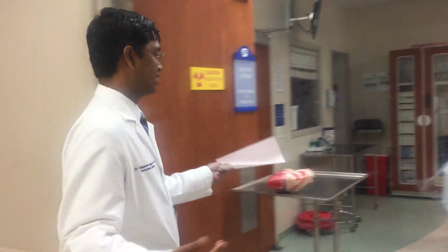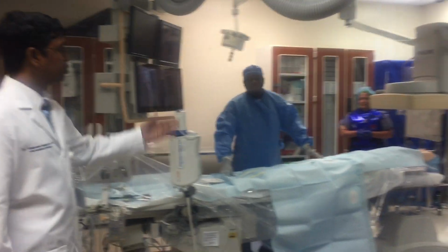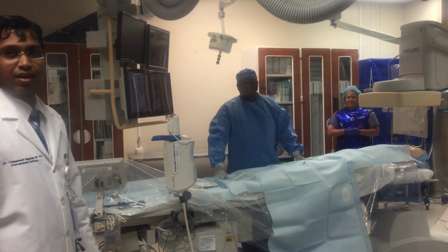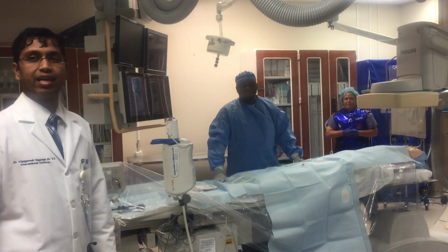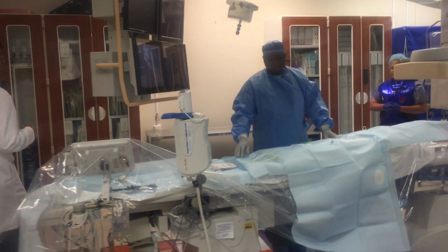This is the interesting part. Now we are going to go into the heart catheterization lab and see how things are. And here is our team: Susie, our nurse, and Mike, our technologist. We all work together in taking care of patients with major heart attacks and minor heart attacks too.